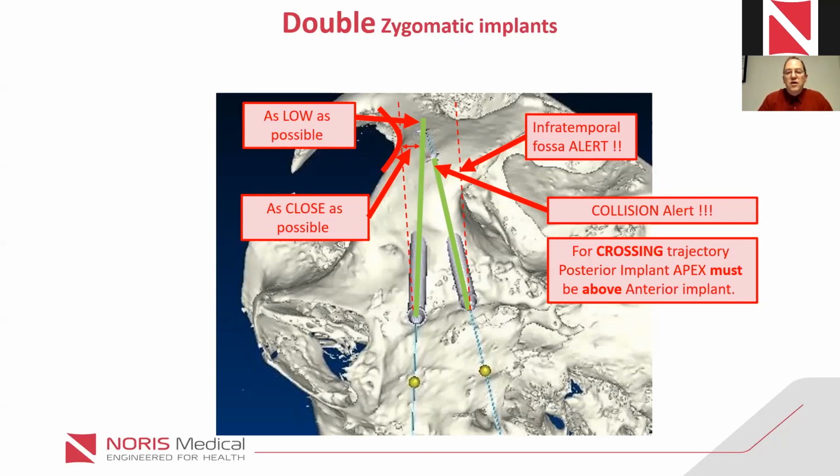Now, if you have a crest which is supporting the implant and enough bone to support the implant for the years to follow without resorption of bone, then you can allow yourself to anchor the implant in the Zygoma bone, even if the bone is shorter than if you would have had the need to do that without any crest support. If you don't have a crest support, you need to have a long portion of the implant, let's say at least 15 millimeter of the implant in the Zygoma bone. If you have that, then basically it's a long cantilever and it will hold.